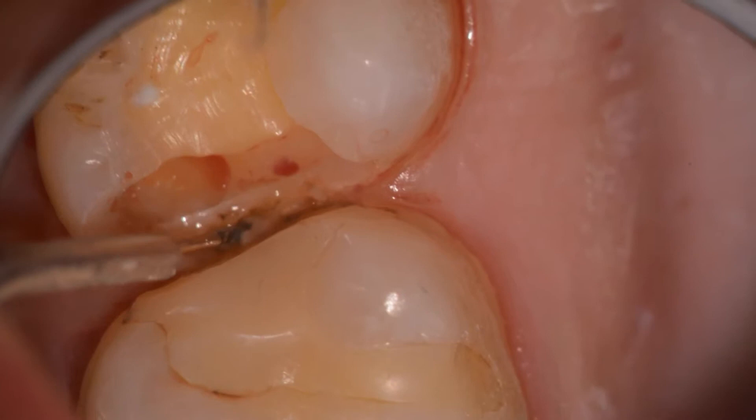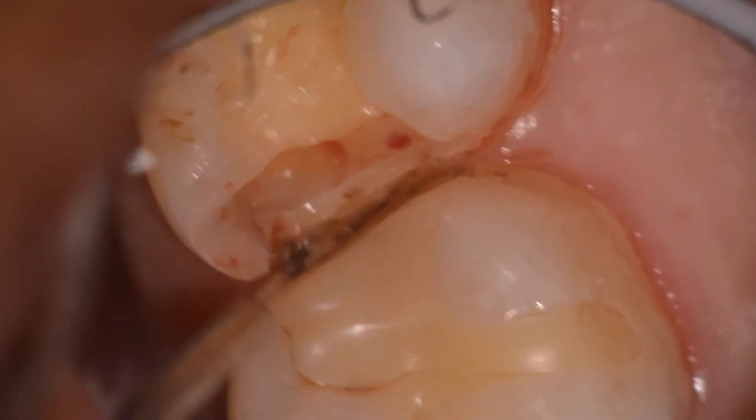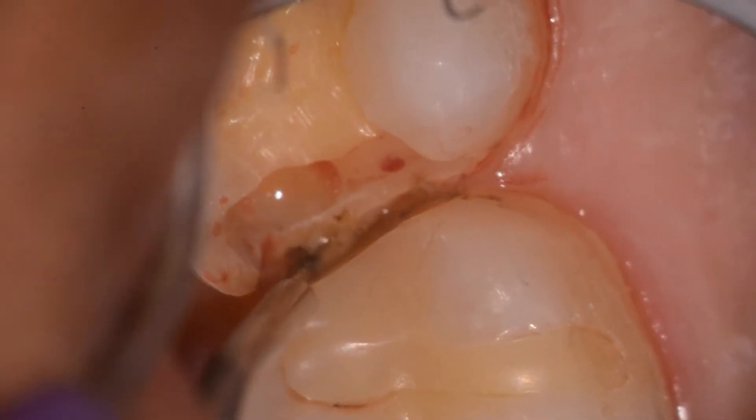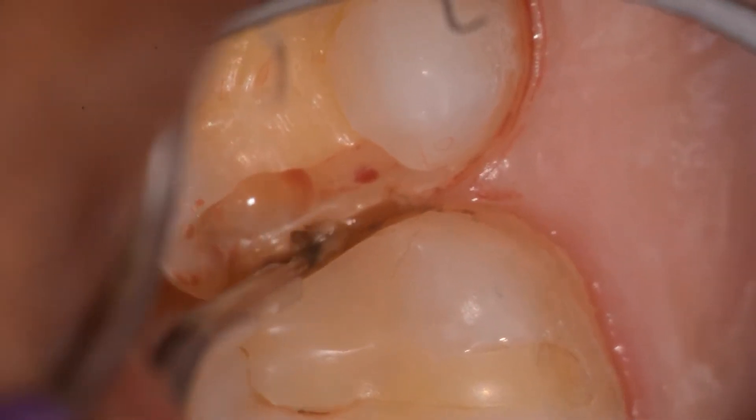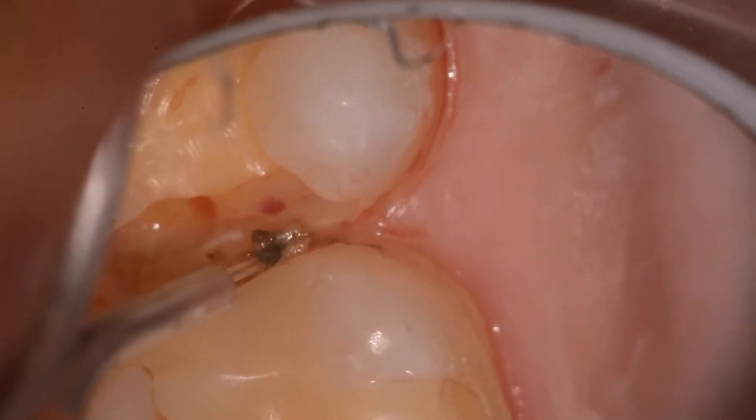What we're doing is actually removing the superficial amount of tissue here, and at the same time, because the diode is well absorbed in hemoglobin, we're able to create a nice clot in a very short period of time.